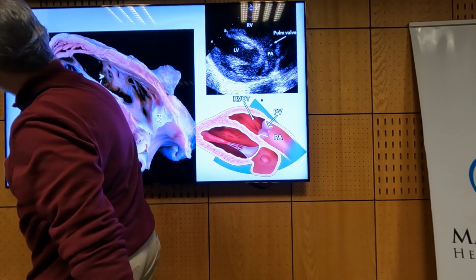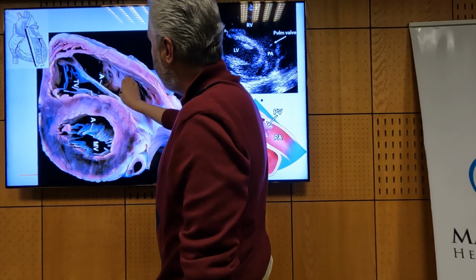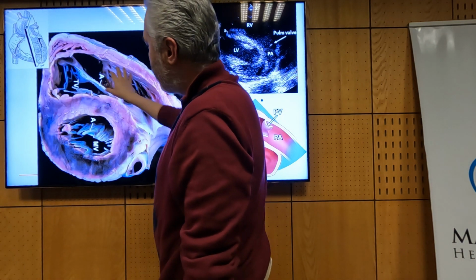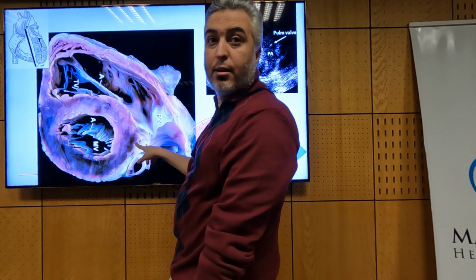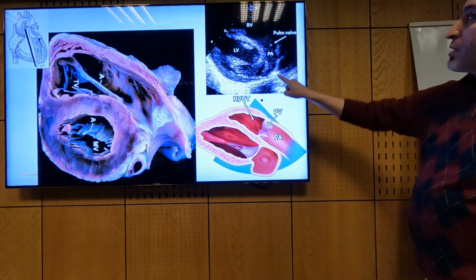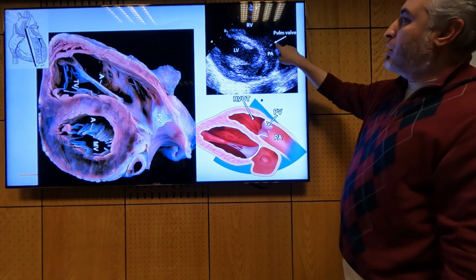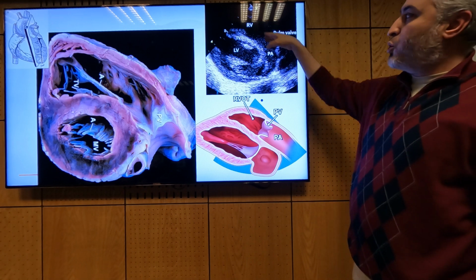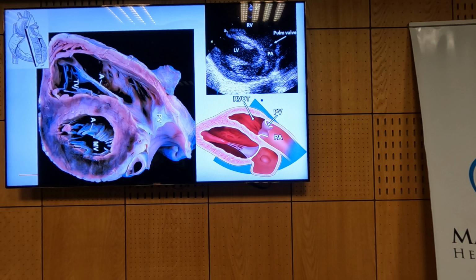This cut section is going across the right ventricle, RVOT, pulmonary valve, and since that is in the long axis, you get the LV as short axis. So this is RV outflow view. And then again, you can align here very well towards the pulmonary valve. You can get gradient measure Doppler here. Okay, so this is RV outflow view.